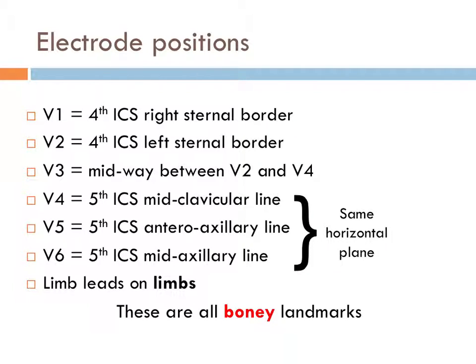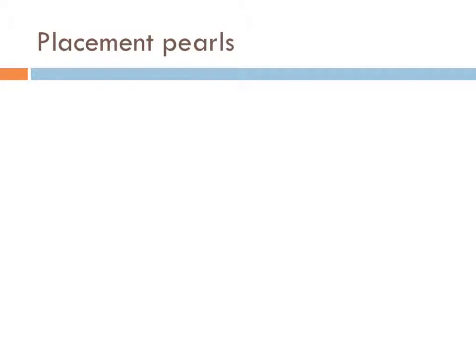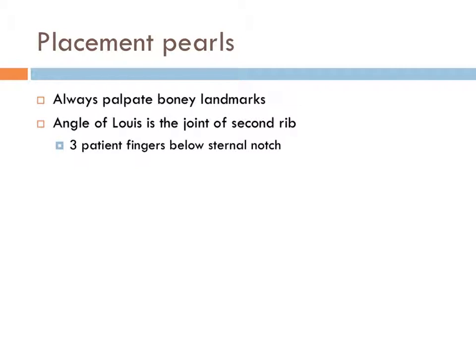Also worth noting, everything that I've talked about here is a bony landmark. This has nothing to do with surface or soft tissues. So in terms of pearls for improving your electrode placement, you need to palpate your bony landmarks every single time that you put electrodes on someone. So for the precordial leads, the one you're going to be looking at mostly is the angle of Louis. This is where the manubrium joins the sternum.